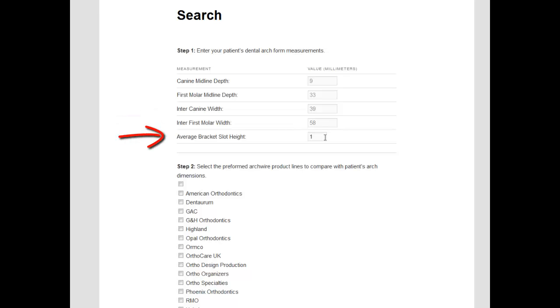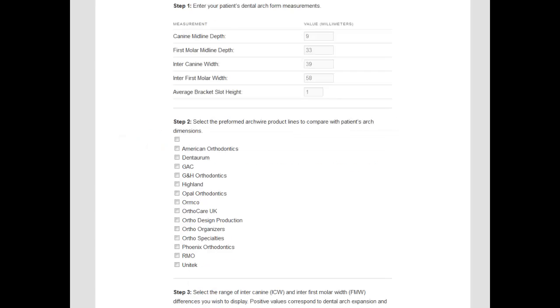We also need to enter average bracket height. Here we will keep the default height at 1 mm. Next, we will select those arch wire manufacturers we anticipate using for treatment. In this case, let us select Highland and Unitec.